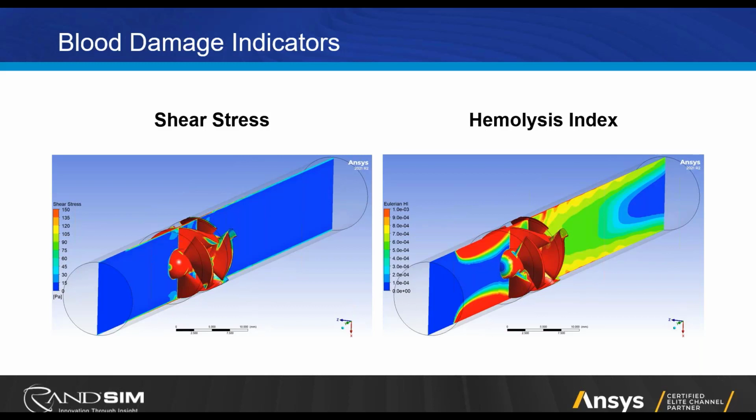Okay, these are interesting results. So if you look at the traditional shear stress and you're ignoring hemolysis, you say, okay, we expect the high shear stress on the blades and the device, and near the walls as well. But it looks like everything's fine through the bulk. In the plot on the right, the hemolysis index, which is the same range from the previous slide, what this is showing you is there are many more regions where hemolysis can occur than you would get from the slide on the left.